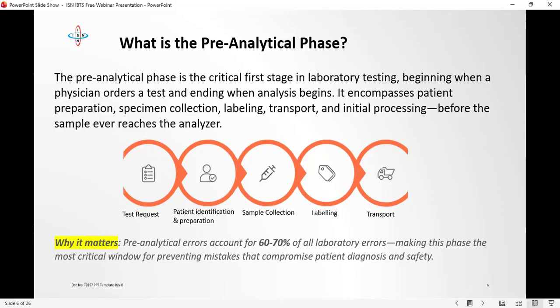All of this can impact that kind of result, because what you're seeing might not be the patient's potassium level. It might be potassium released from the red blood cells due to hemolysis, okay? So when you see results like that, the good laboratory practice personnel will always calm down and ask questions. And that single moment of questioning can be the difference between saving a patient from unnecessary treatment and causing harm to the patient. So let's look at the pre-analytical phase.